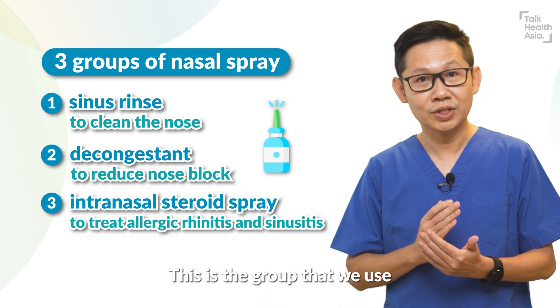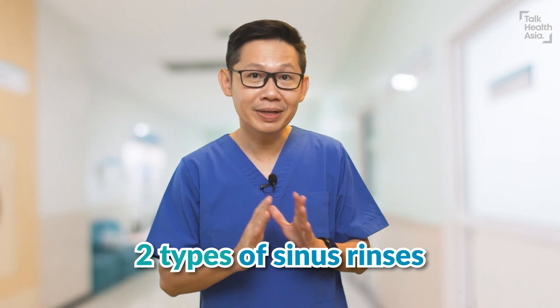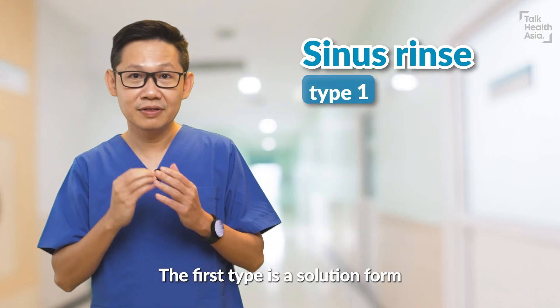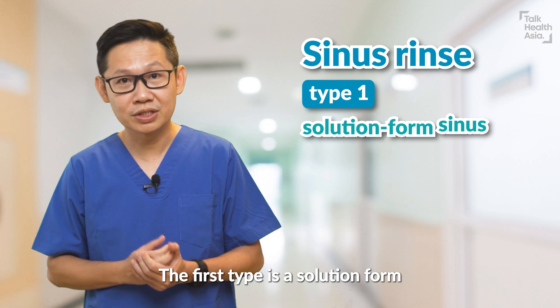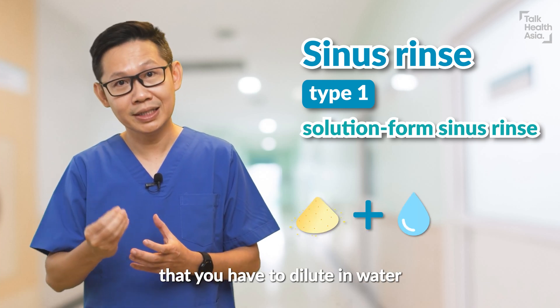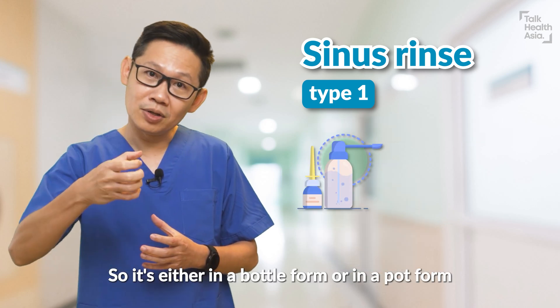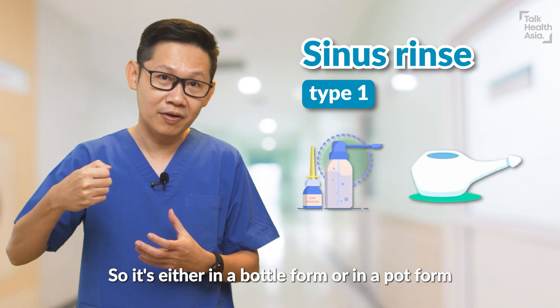Intranasal steroid spray is the group that we use to treat allergic rhinitis and sinusitis. For sinus rinse, we have two main types. The first type is a solution form, where it usually comes with a powder that you have to dilute in water, either in a bottle form or in a pot form.